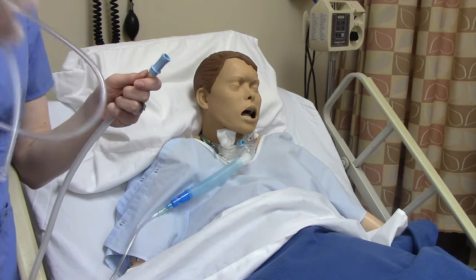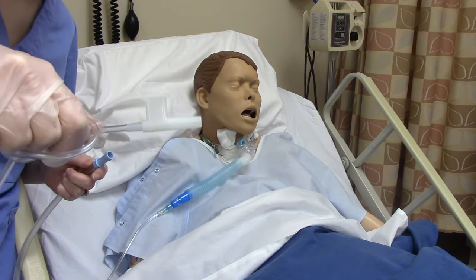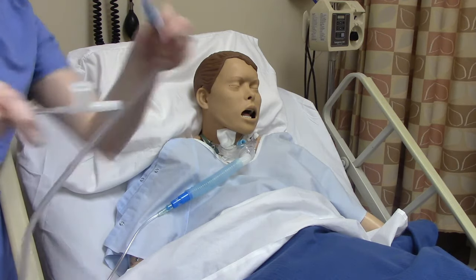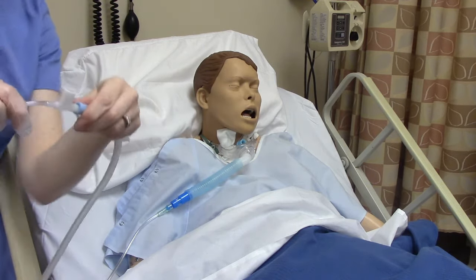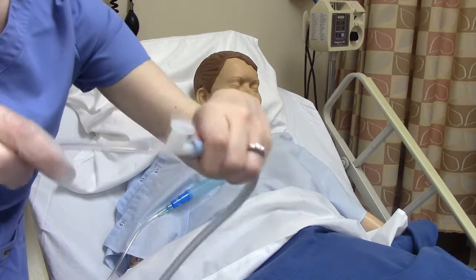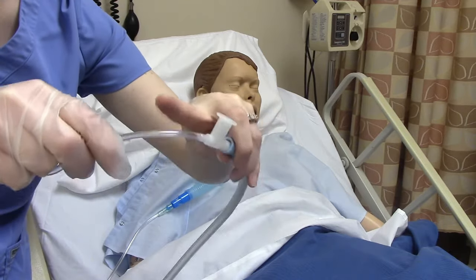Take the catheter and curl it up in your hand so you have a little bit sticking out. Now we have it coiled up — we're going to plug this part into our suction. The principles of sterility still apply: about an inch out of this tubing is also considered contaminated and not sterile.